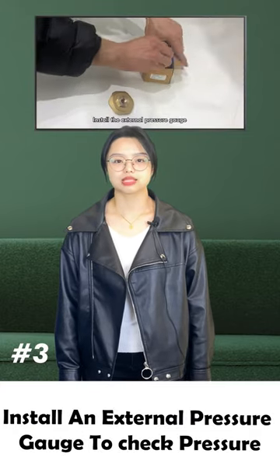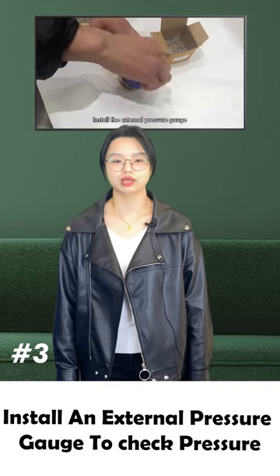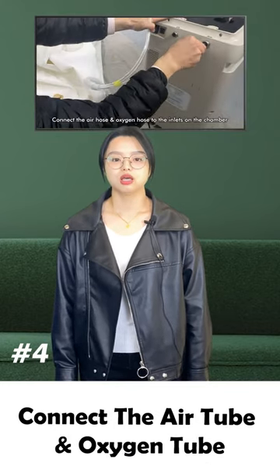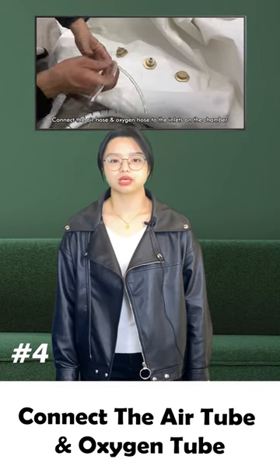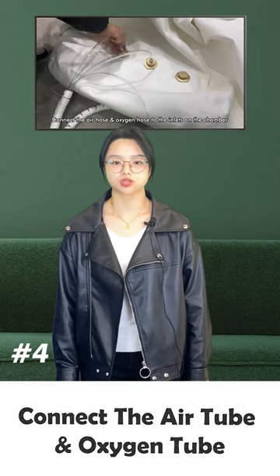Thirdly, it is necessary to install an external pressure gauge to check whether the oxygen chamber pressure is normal. Next, connect the air tube and the oxygen tube to the inlets on the seated inflatable hyperbaric oxygen chamber.